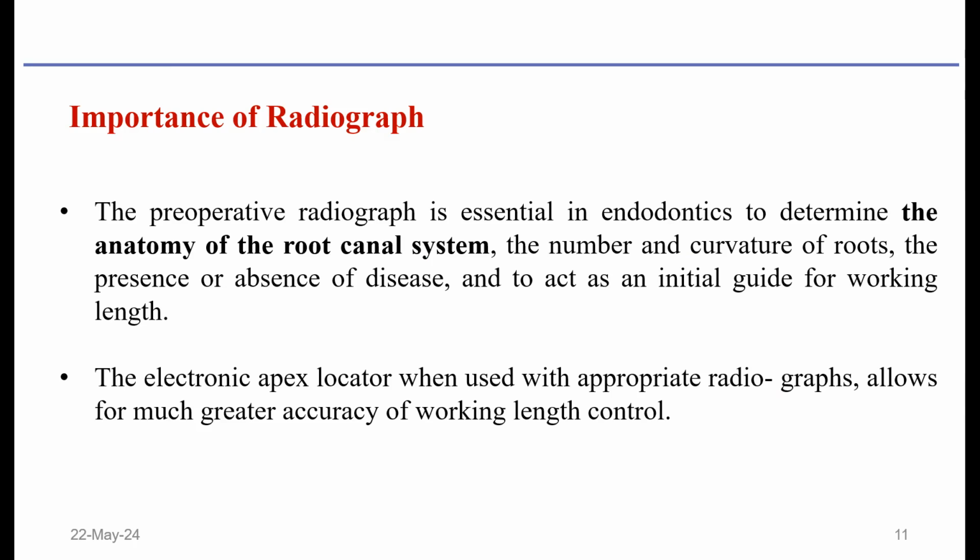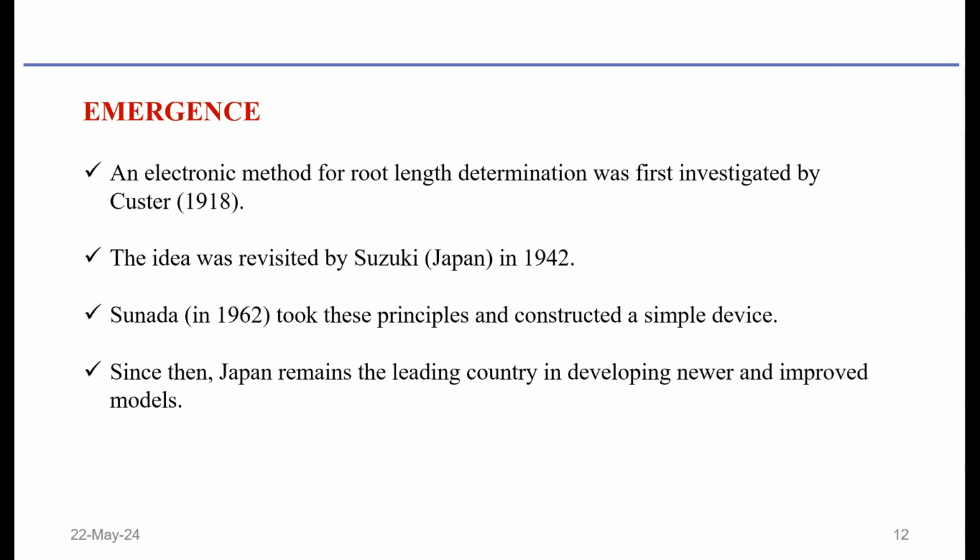Radiograph is always required, maybe along with the help of an apex locator. Our results might be much more predictable. So that's the reason we cannot completely neglect a radiograph. The electronic apex locator, when used with appropriate radiographs, allows for much greater accuracy of working length control.